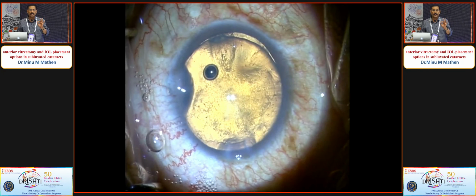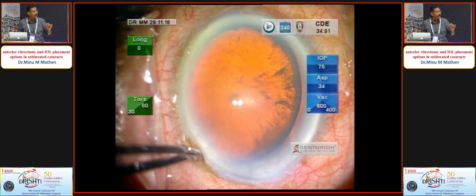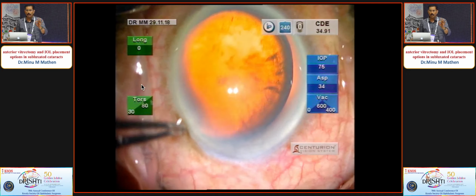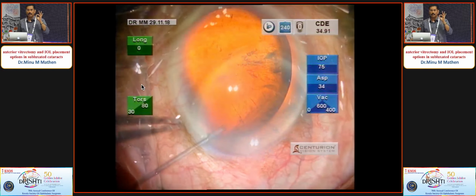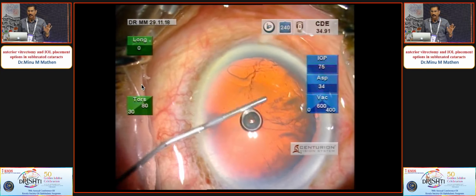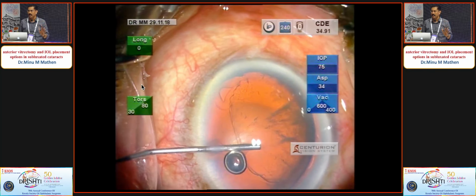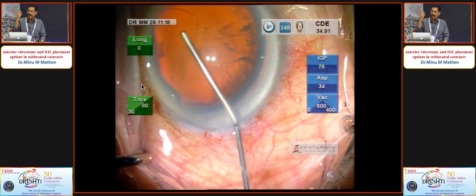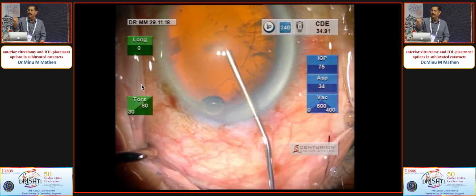Viscoelastic is not just HPMC. See, in this case, there is no vitreous here, but this is a large area of dialysis. From anywhere through that area you can get vitreous coming out because of the irrigation, aspiration and all which happens. So I would use Viscoat or Healon Plus. No financial interest in any of this, but these are the dispersive ones which will remain in position. Cohesive ones will get aspirated off immediately when you go near it with the aspiration port.